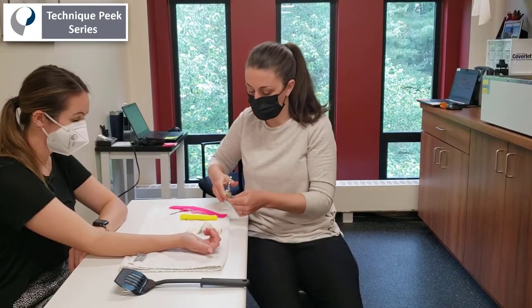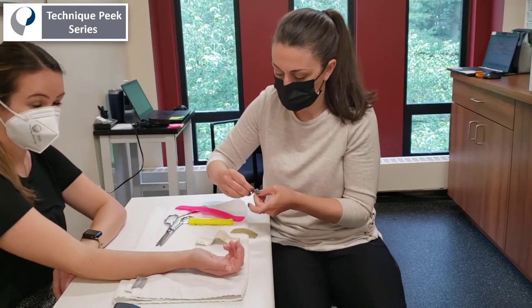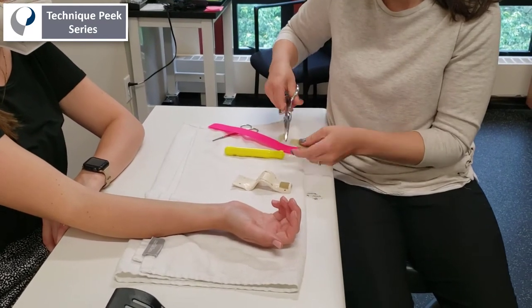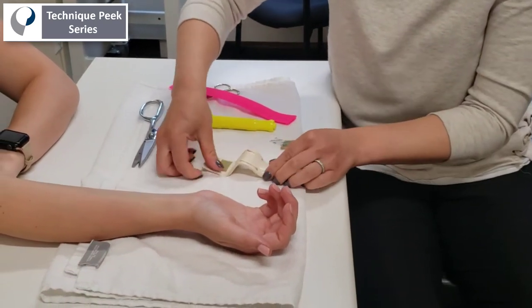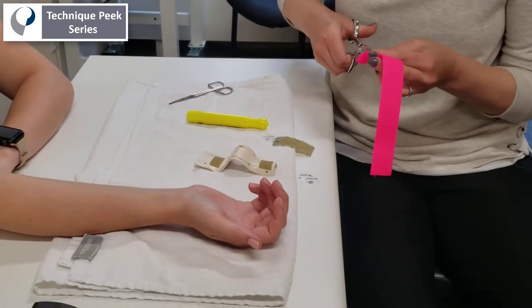Once it's hardened, you're going to apply the Velcro straps. We're going to zoom in a little bit so you can see better. You can put one piece of Velcro hook proximally and one distally. Then you're going to want to taper your strap to be easy to feed through the little slits that were previously created.